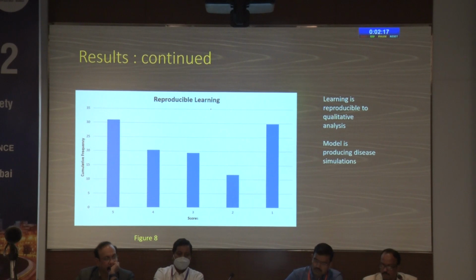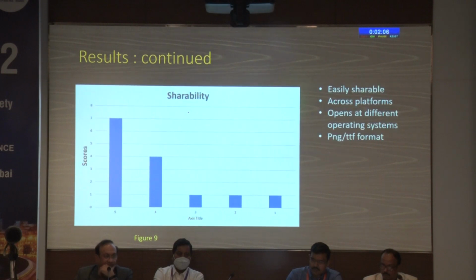Now this reproducible learning, is this reproducible or not? The cumulative frequency shows that it is reproducible in case of 5. Now this is a pilot project. This just gives a crude idea. And shareability, definitely it's shareable across the platforms.